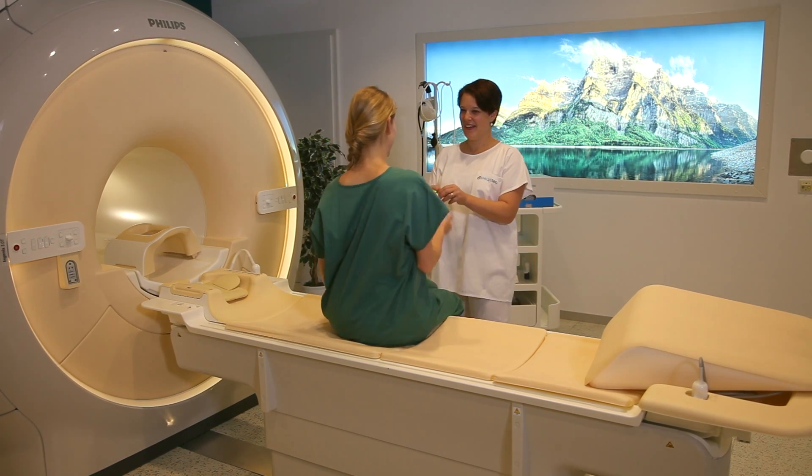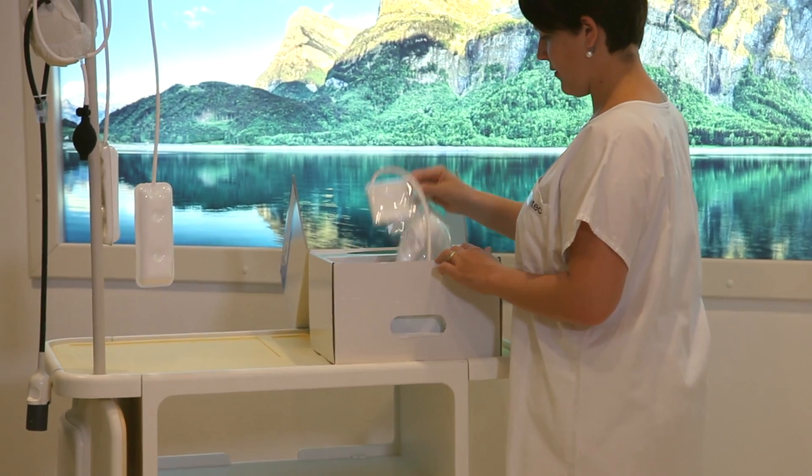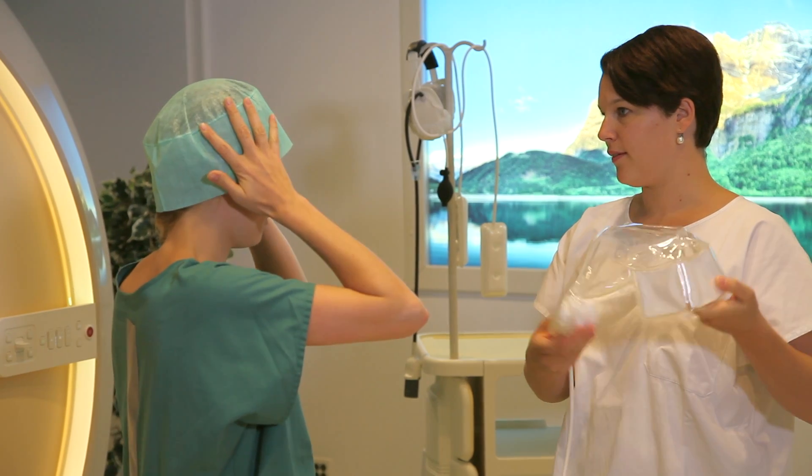Welcome and start to prepare your patient for the scan. First, remove a hygienic single-use head cover from the box and place with the front of the cover positioned above the eyebrows on your patient's head.